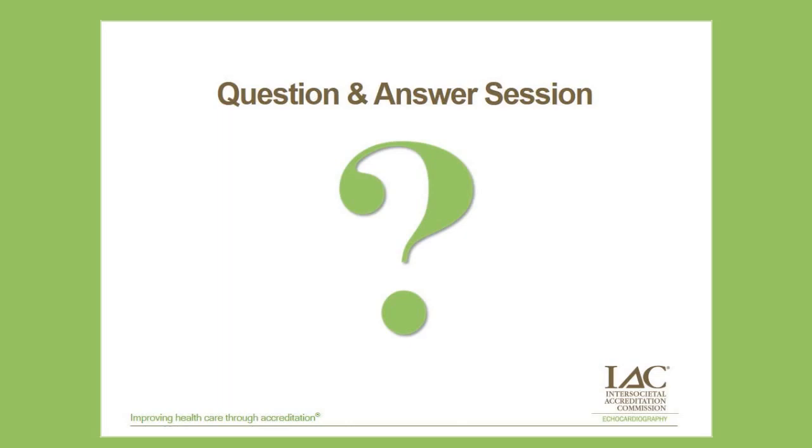Okay, Susan asks, if a patient's baseline strain is abnormal and they are getting ready to start chemo, do you still use a change of 15% to identify toxicity and LV dysfunction? Well, if your strain is already abnormal, I think what is important is what is your baseline ejection fraction? Are you already adjudicating evidence of LV dysfunction?